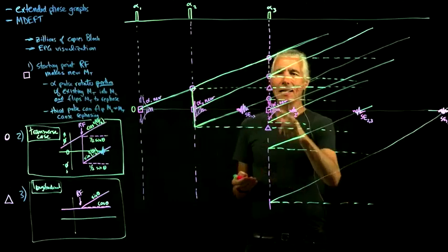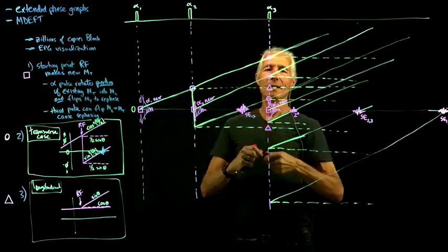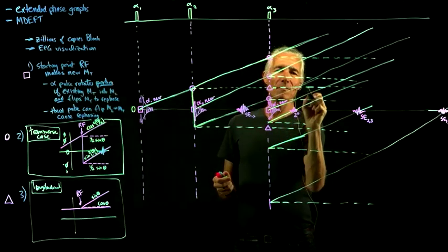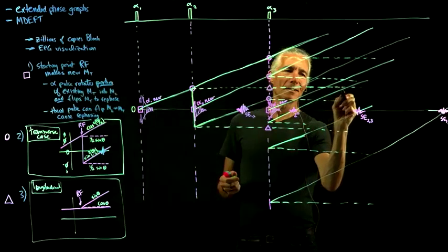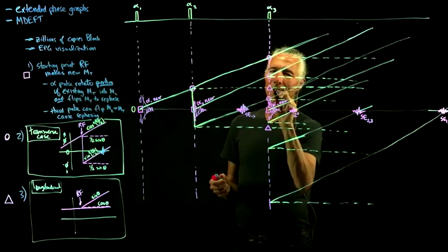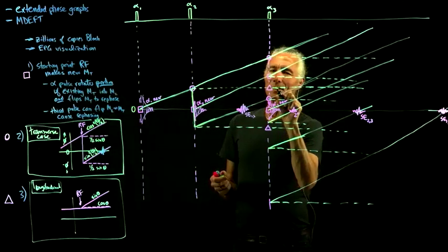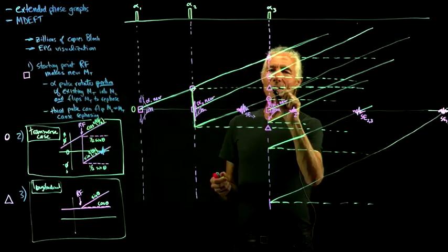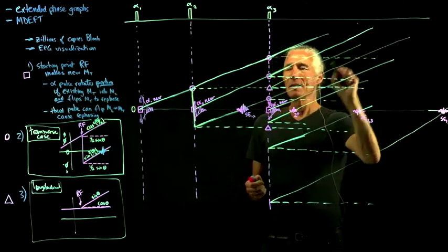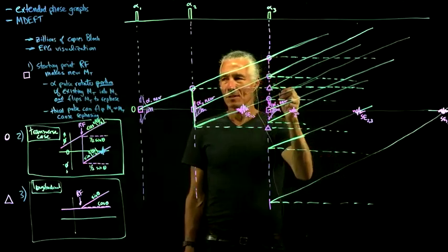What happens at the triangle is that we get some saved magnetization, a portion of the magnetization as saved transverse that was sort of saved into the longitudinal, but then we turn some of it into transverse. And this guy just goes off into oblivion. It's not going to make an echo. And so that one just sort of goes away.